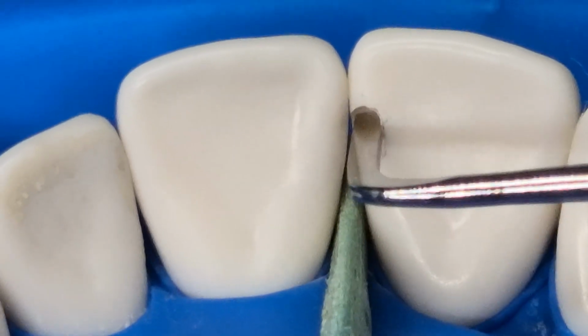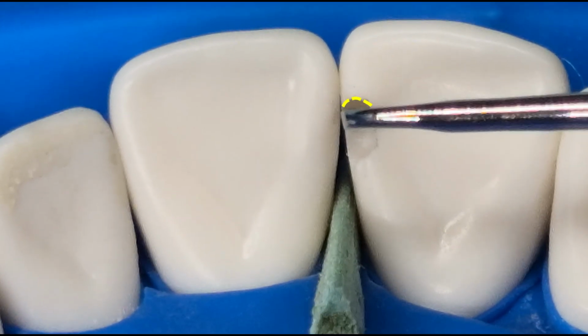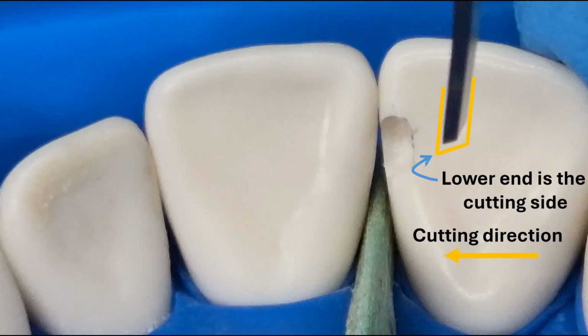You see the enamel lip there? It's hard to remove it with the burr without injuring the adjacent tooth. So it's probably a good idea to use a hand instrument like an enamel hatchet. Remember, when using the enamel hatchet, the lower end of the bevel is the cutting side.